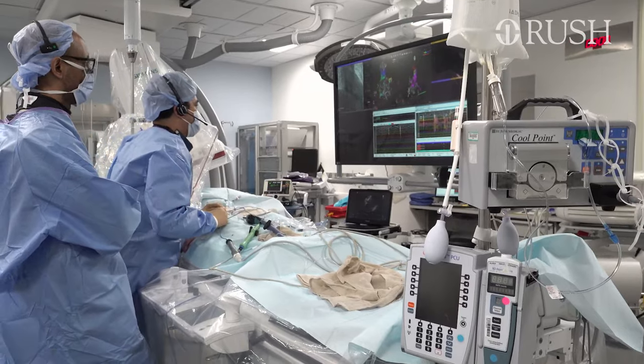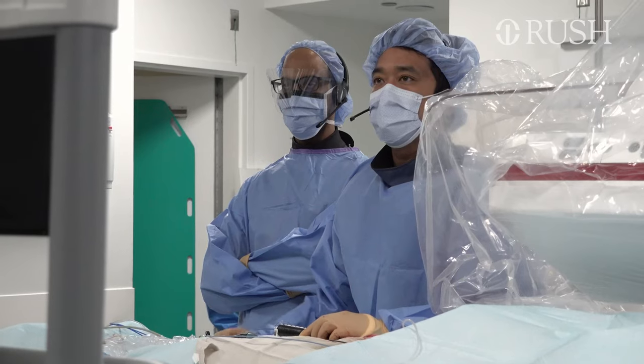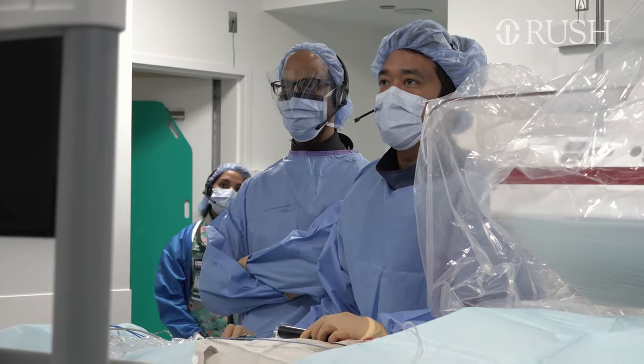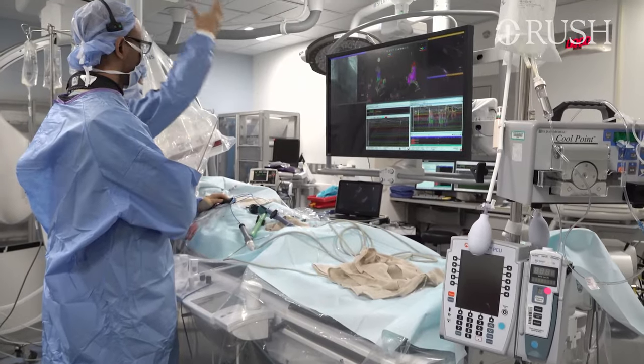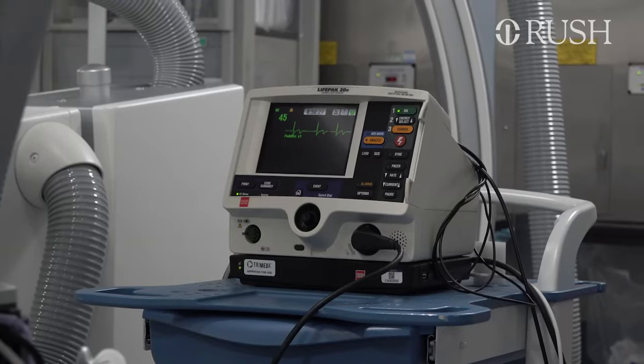We got everything right. It's a good sign, this area that was electrically active. We're stimulating the heart to go faster, but it's not able to capture any of the heart muscle to make it go faster. So we know this ablation's been effective.